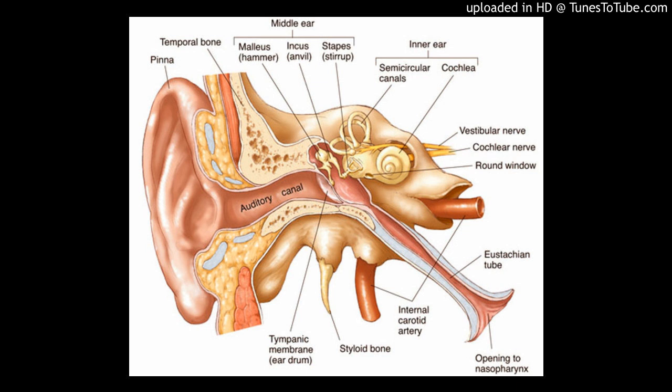The formation of a mastoid cavity by removal of the canal wall is the simplest and most effective procedure for facilitating the removal of cholesteatoma, but may bestow the most lasting infirmity due to loss of ear function upon the patient treated in this way. The following strategies are employed to mitigate the effects of canal wall removal.